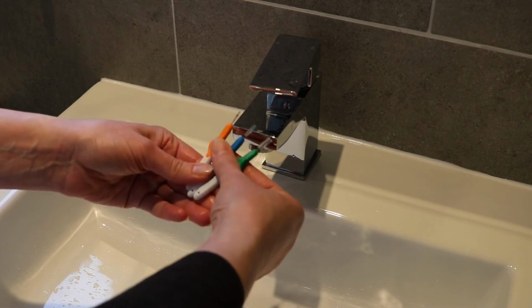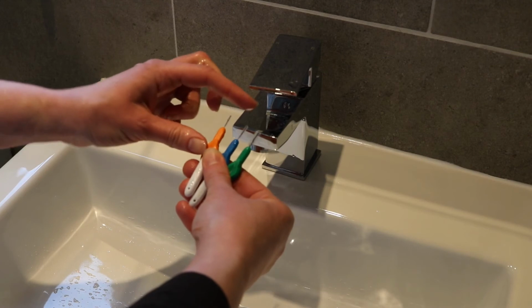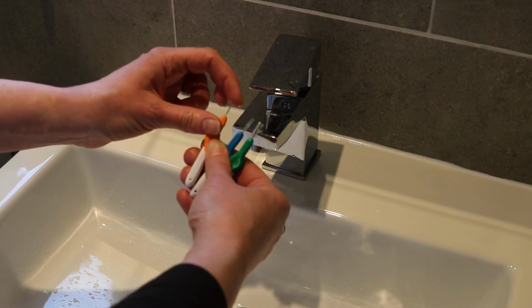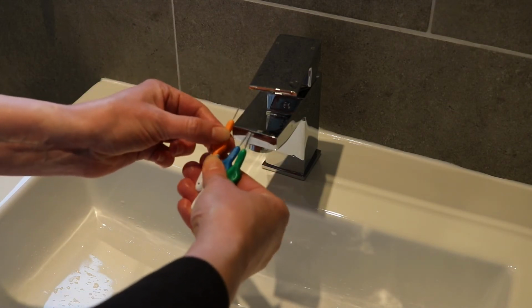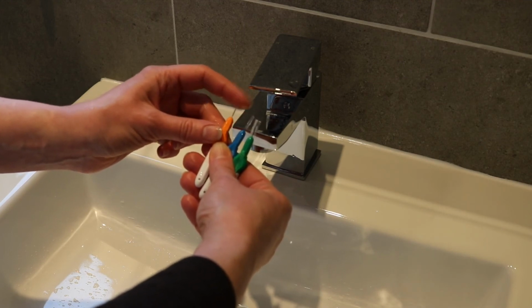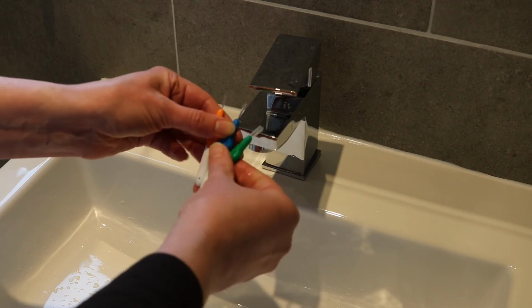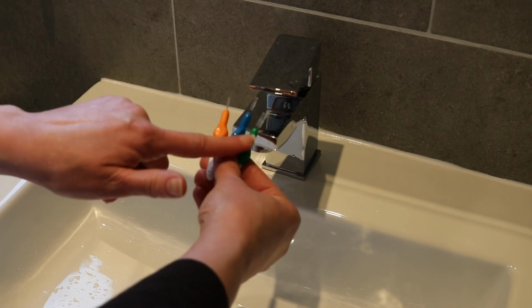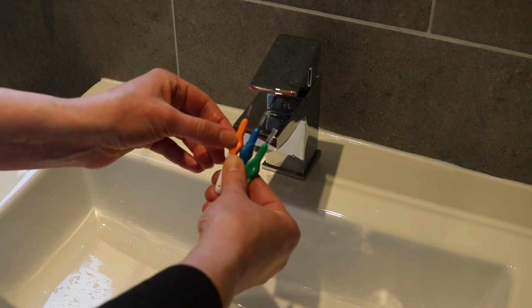Most interdental brush companies say that the brushes should last about a week. However, I do find that some of the smaller ones maybe bend before the week's out, so you may find that you're using 2 a week, especially when you're first learning how to use them, because it takes a little bit of practice knowing which angle to put it in between each tooth. But as you get better, you probably find that you use less. Larger sizes, they'll probably last you a week, but the smaller sizes you may just find you're using a few more.